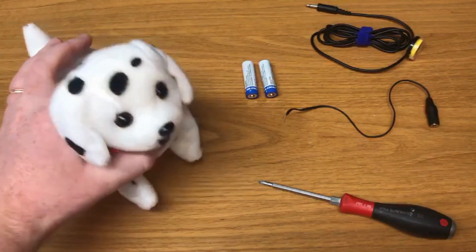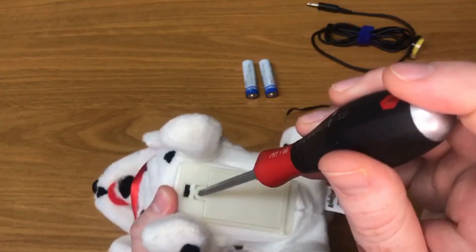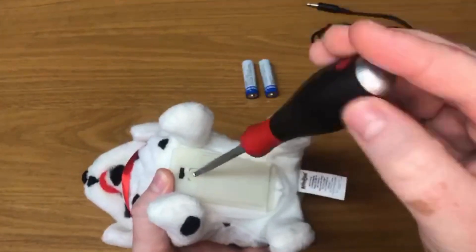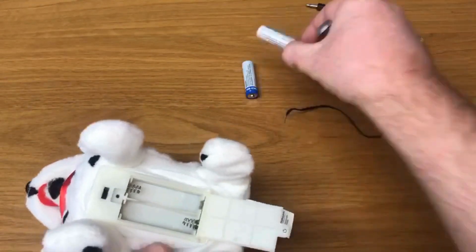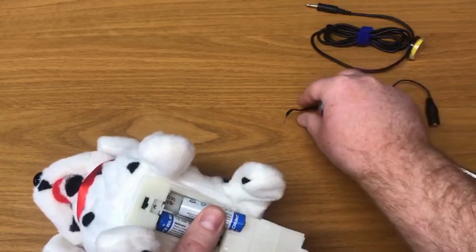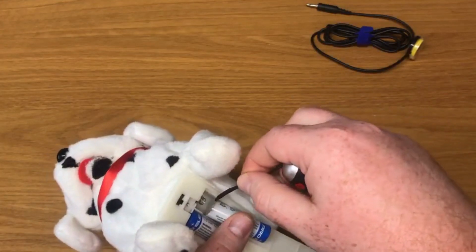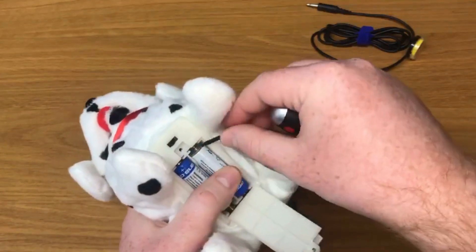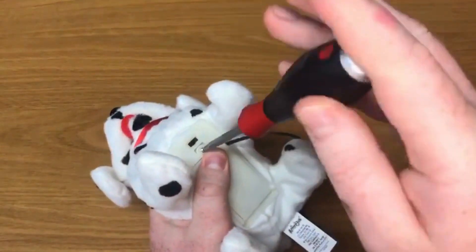First we will install the batteries inside the toy. Make sure you open the battery compartment. Install the first battery. When installing the second battery, attach the switch adapter contact pad on the negative end of the battery and slide the battery in. Close the battery compartment and secure it safely.